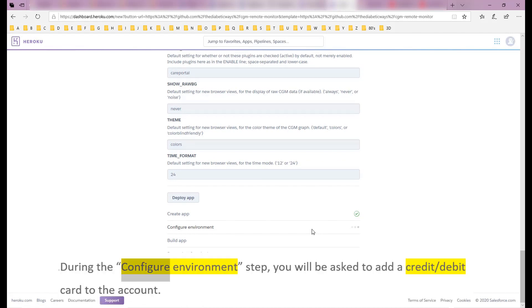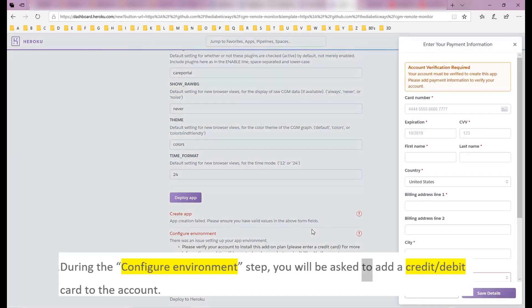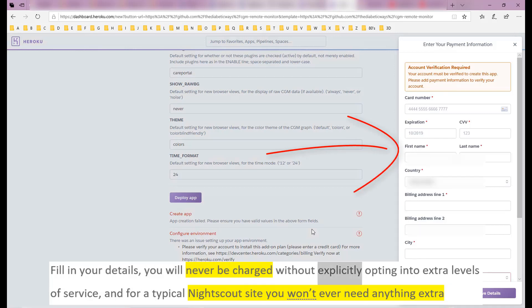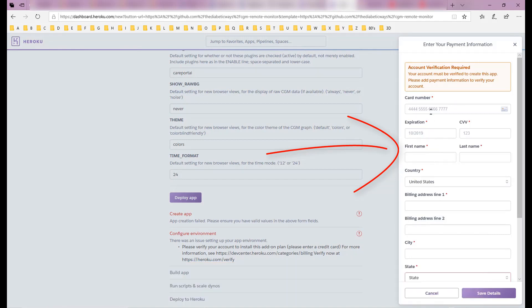During the configure environment step, you will be asked to add a credit or debit card to the account. Fill in your details. You will never be charged without explicitly opting into extra levels of service, and for a typical Nightscout site you won't ever need anything extra.